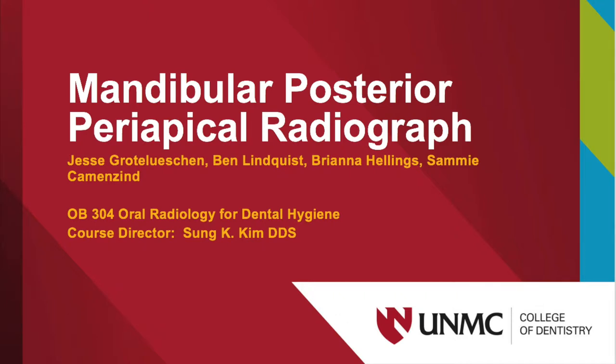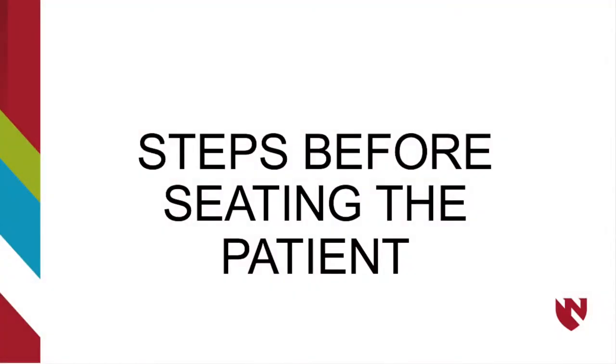This video will demonstrate and explain how to capture mandibular premolar and molar periapical radiographs. Before seating the patient, a few things must happen.